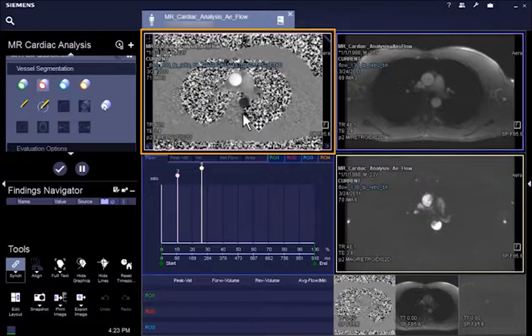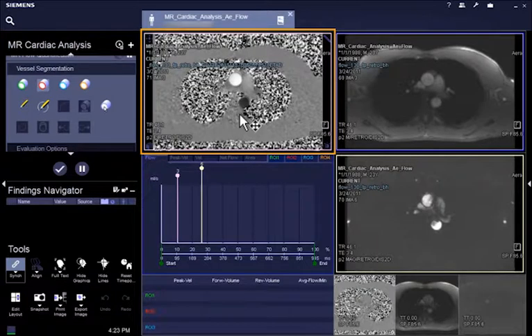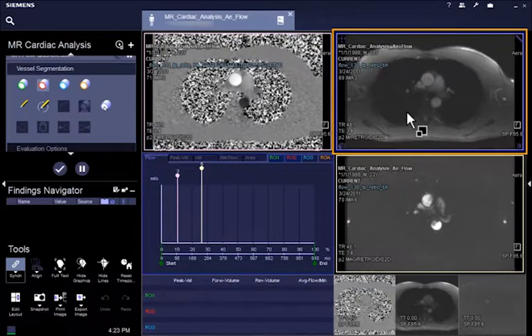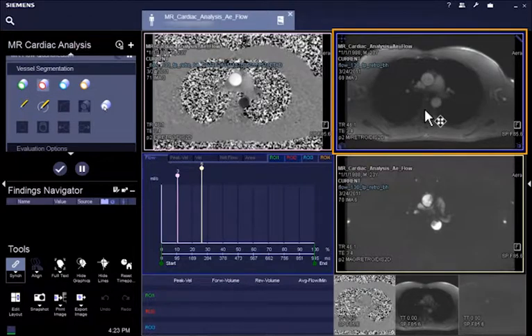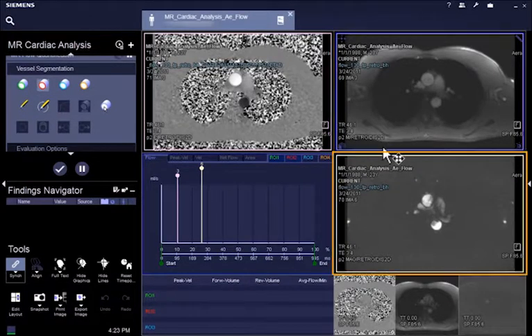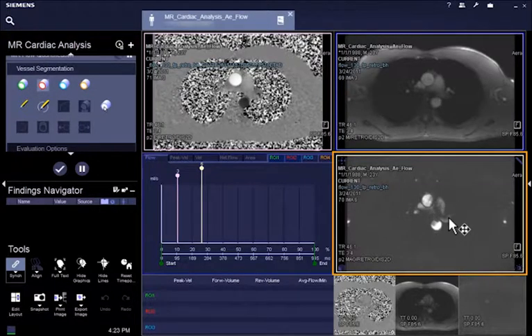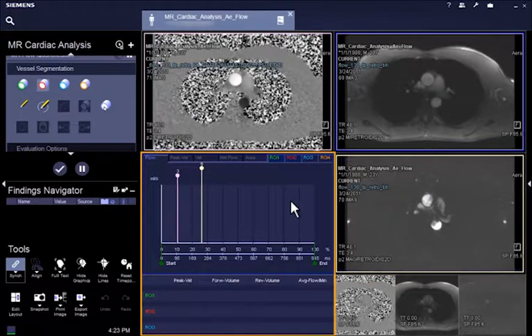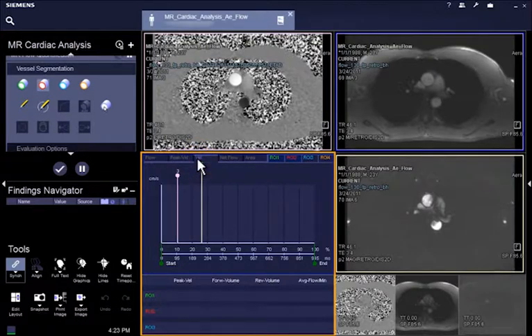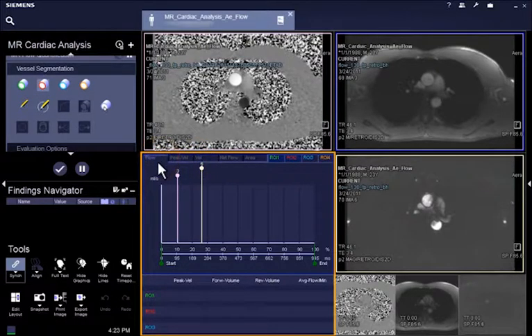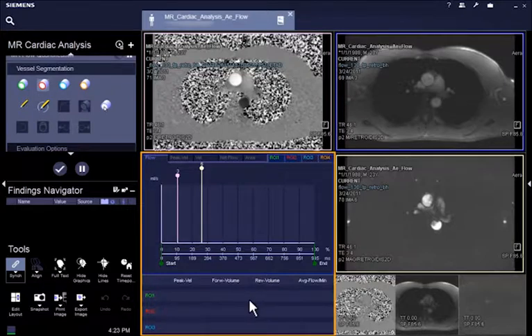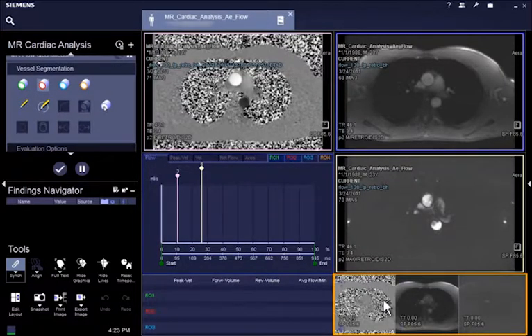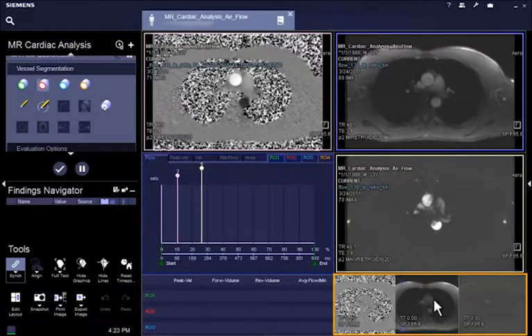The left top segment displays the phase contrast images containing the flow information. The right top segment displays the magnitude images, while the right center segment displays the phase contrast angio-like PCA images. The left bottom segment shows the time flow graph with quantitative results. The bottom right gallery segments show the same images as loaded in above segments.